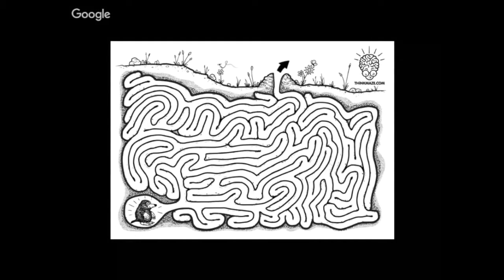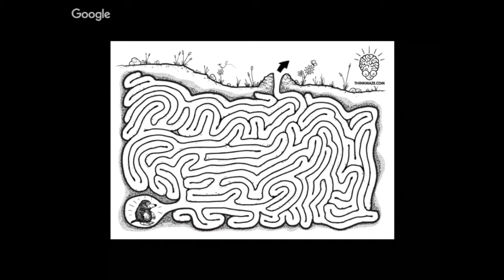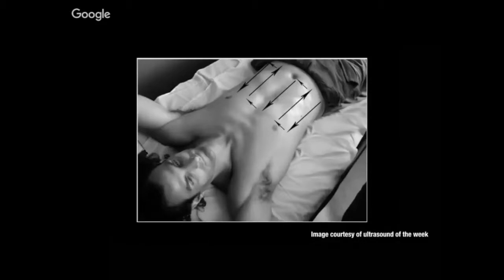Empty small bowel in a healthy child is really like a maze — it moves around and is a big central conglomeration of a very long tube. We're going to approach it in a systematic way. The approach we recommend is what we call lawnmowing of the abdomen: going in an intentional and comprehensive way across the entire abdominal wall to visualize areas that might be suspicious when we have a high pre-test probability or a history consistent with small bowel obstruction.